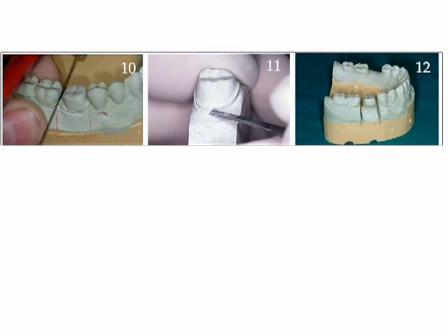Step 5. Finish the preparation. Ensure that the surface is uniformly smooth with glassy smooth finish lines. A finishing diamond may be used on the slow-speed handpiece. Round all line angles. Inspect the tooth for adequate clearance both in MIP and all lateral excursions.